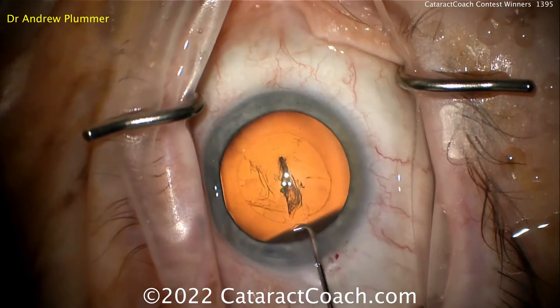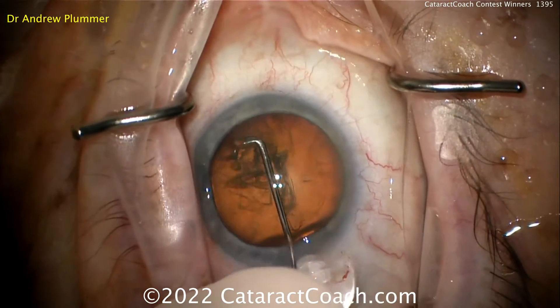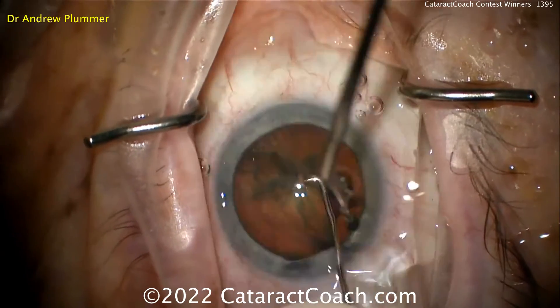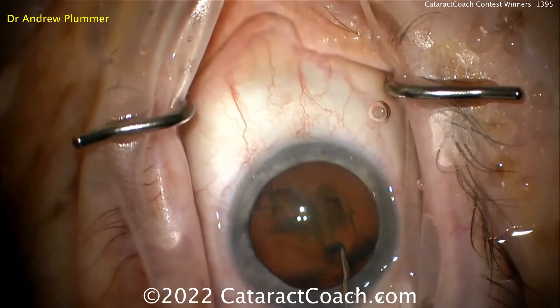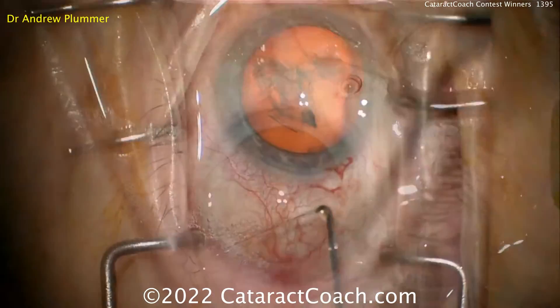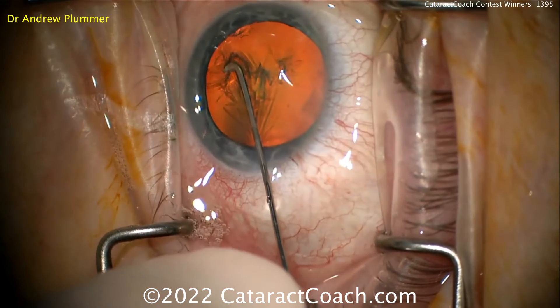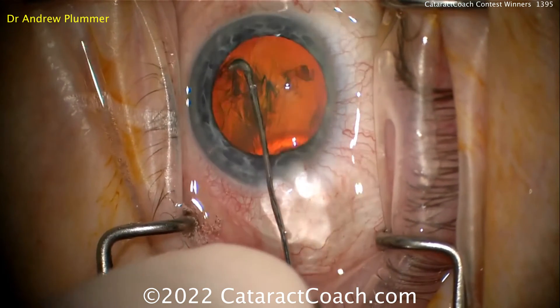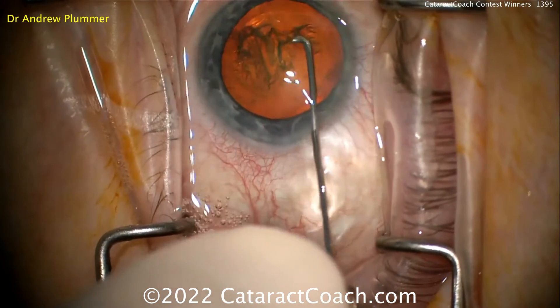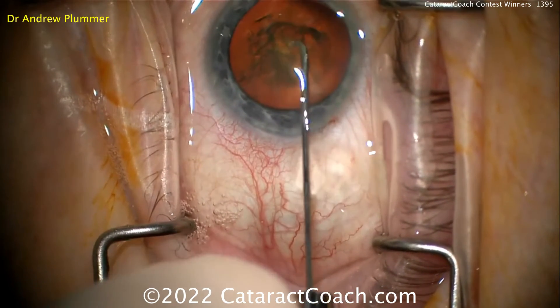Let's see that in action. We send the fluid wave across, depress the lens, and you see that little gush of fluid come around the anterior lens capsule on the opposite side, and the lens spins very nicely. A few other tips to help beginners learn hydrodissection: I like to clear the cannula. In all of these clips you'll see me squirt some fluid before I go into the eye. That makes sure there are no obstructions, that you've got all the air out, and confirms the cannula is firmly attached.